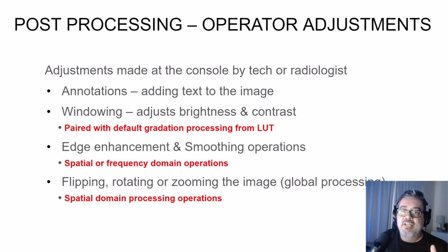But you can annotate arrows, for example, where the pain might be, or type upright or prone to better communicate to the radiologist the important specifics about the exam.